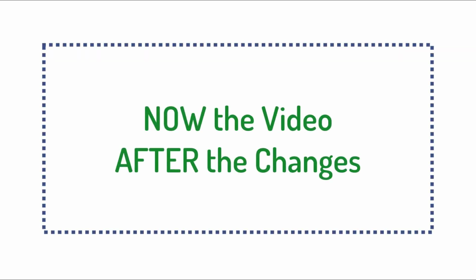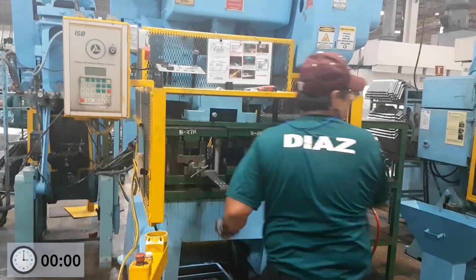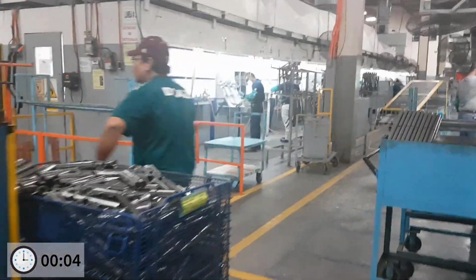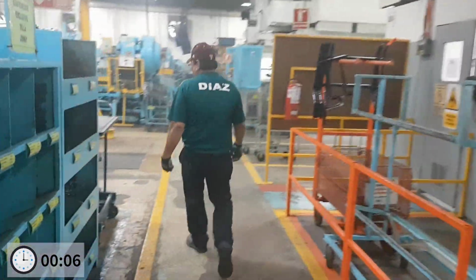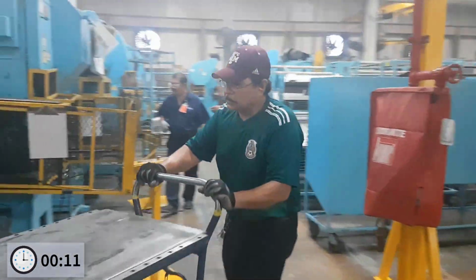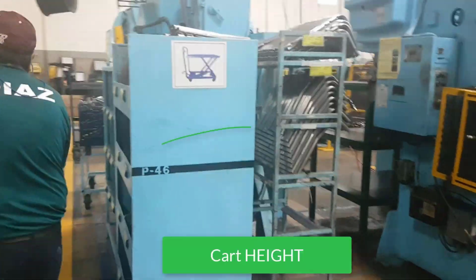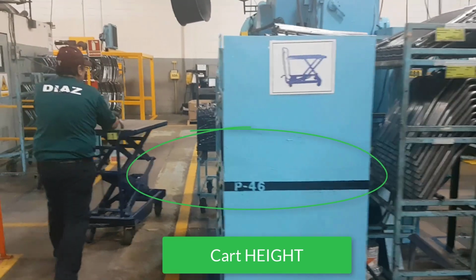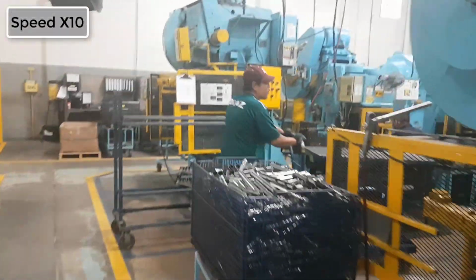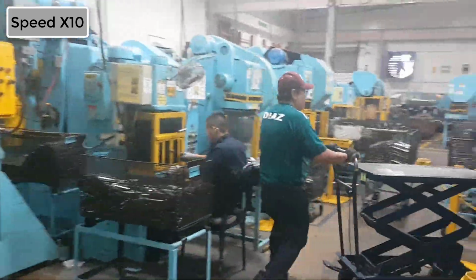Now let's watch the video after the improvement. The setup guy has to walk only a few steps to get the cart, and the height of the cart is already adjusted at the same level of the bolster press. Take a look on the green circle. So he doesn't have to use the pedal multiple times, only take off the old die and place the new one.